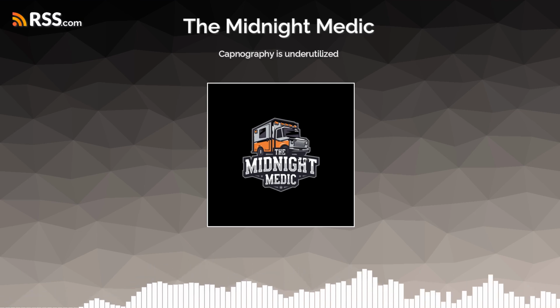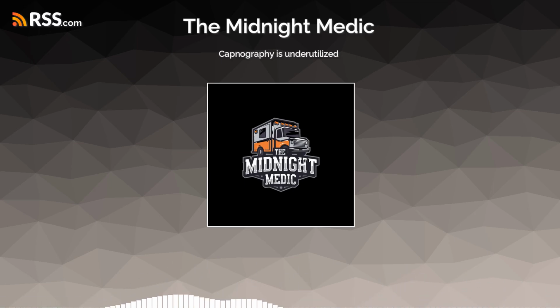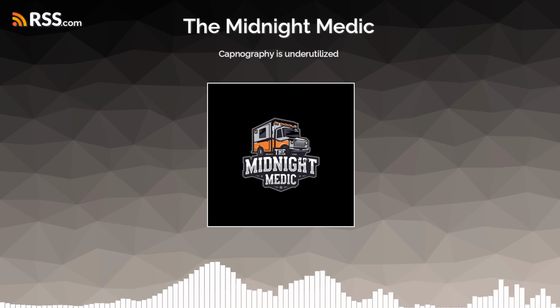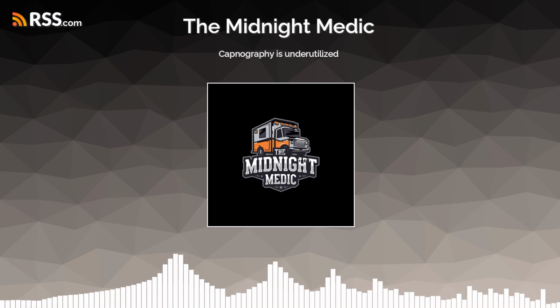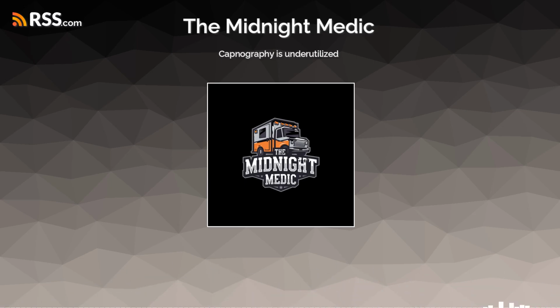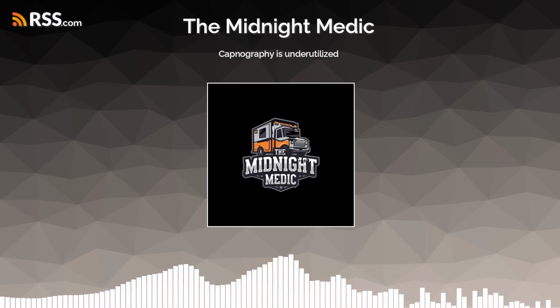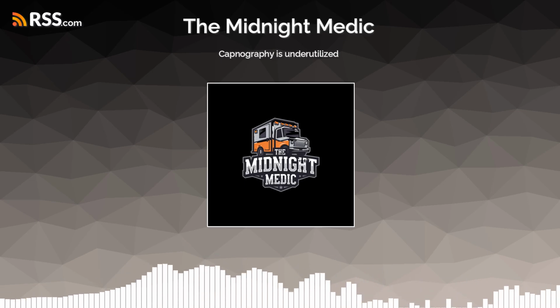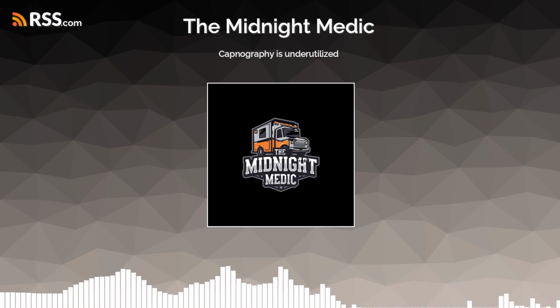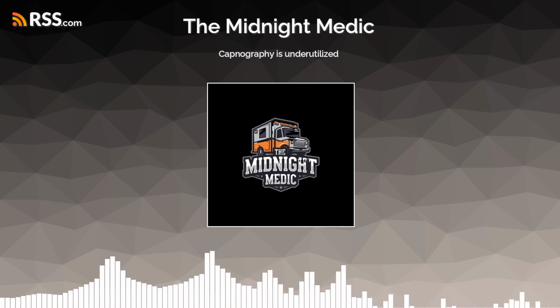Welcome to the Midnight Medic Podcast, the podcast where we break down critical pre-hospital topics to keep EMS professionals informed and prepared. I'm Will, and today we're focusing on an essential yet oftentimes underutilized tool in emergency medicine, capnography. Capnography is more than just a fancy waveform on your monitor. It provides real-time insight into ventilation, perfusion, and metabolism. Whether you're confirming airway placement, assessing respiratory status, or monitoring CPR effectiveness, capnography is a game changer in EMS.